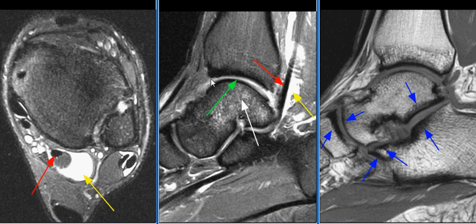There is mild osseous edema of the talus at the superior aspect of the sinus tarsi, consistent with stress edema. The MR findings are consistent with flexor hallucis longus tenosynovitis and stress edema in the talus.